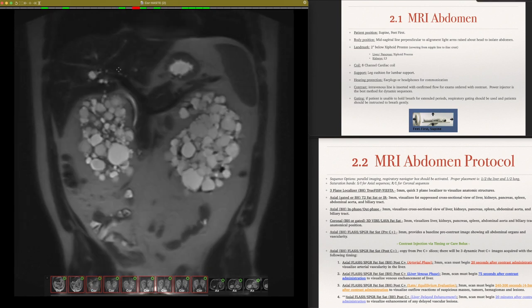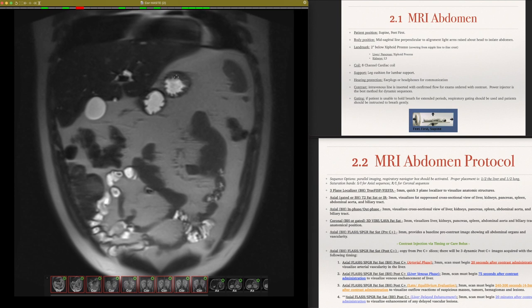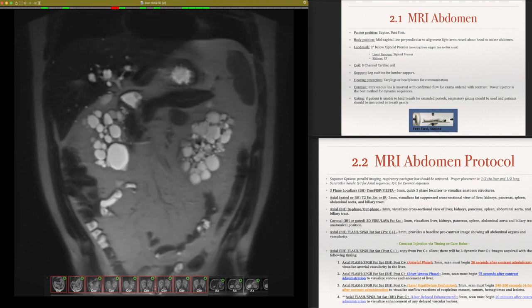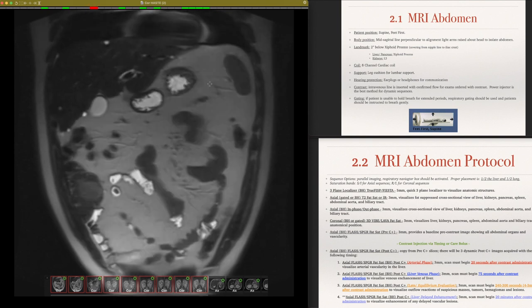Okay. So as you go through, you'll see that this is the stomach here, and we'll see something interesting on this case. You can see that it's full of white. This stomach is actually coming directly at us, so it looks like it's in cross section. When we're in the axial plane, it'll be in profile. So right now it's in cross section. You can see the pancreas here as well, which is usually pretty retroperitoneal, so a little bit posterior in the abdomen.